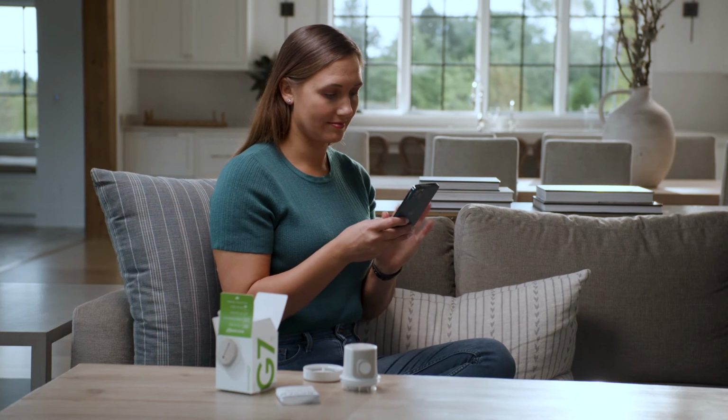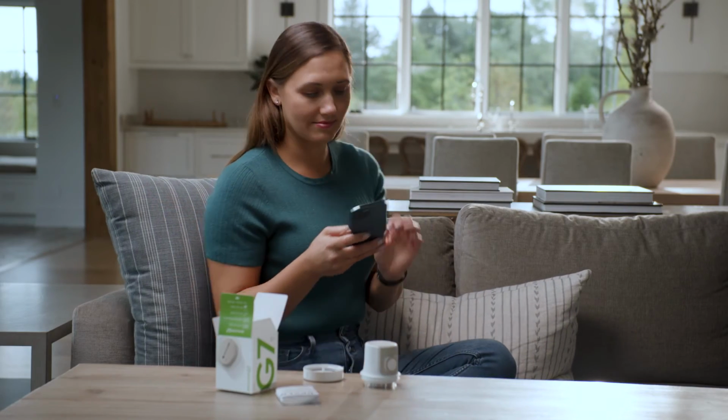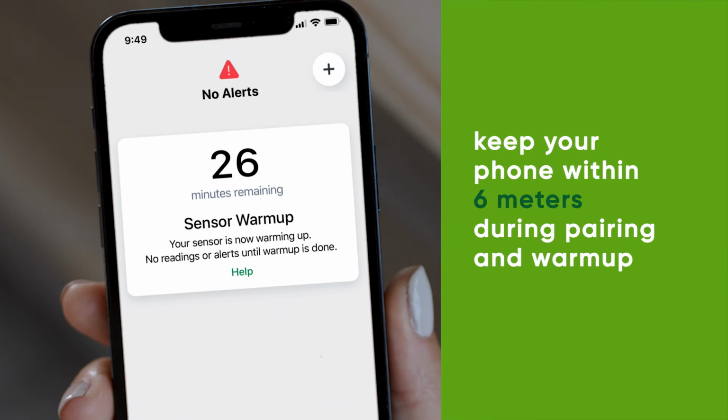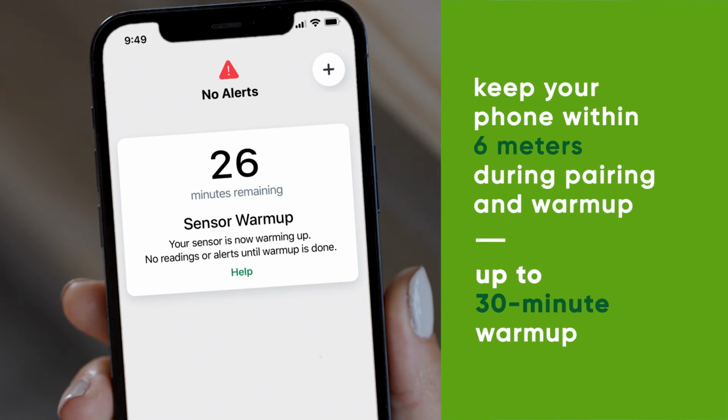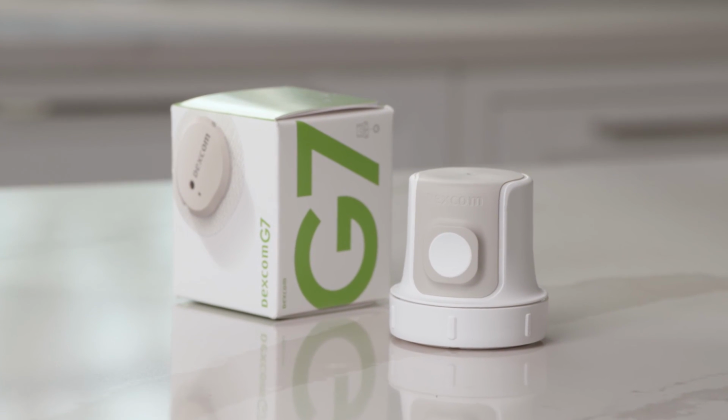Back on the app, confirm your sensor is inserted and enter your pairing code. Enter the pairing code by taking a picture. Wait for the sensor to pair. Tap OK on the Pairing Complete screen and enter into your sensor warm-up. The sensor warm-up timer lets you know when you'll start getting readings and alerts. And that is how you replace your Dexcom G7.